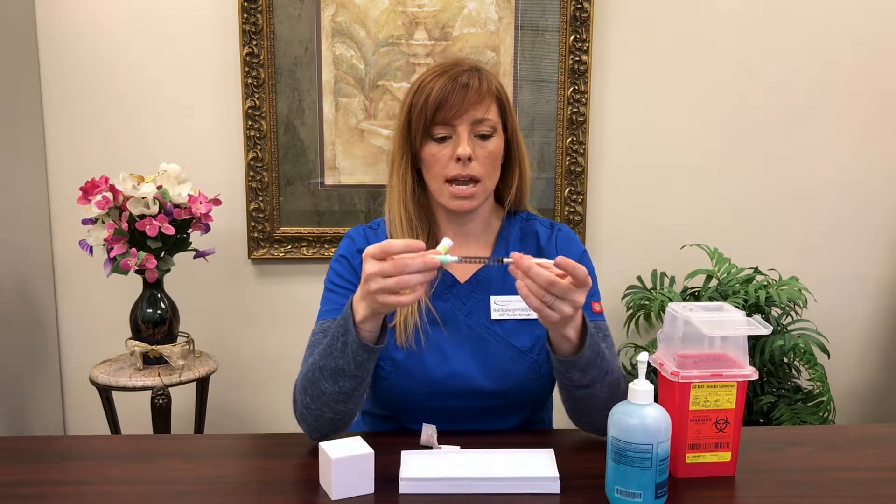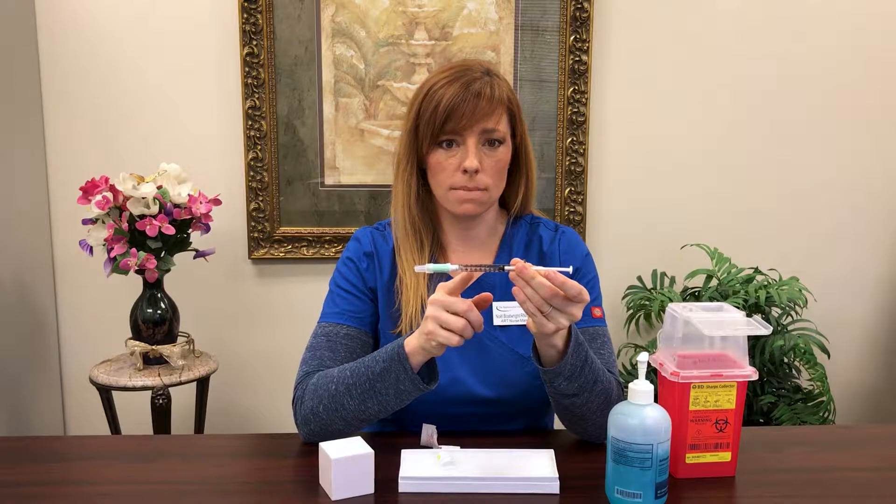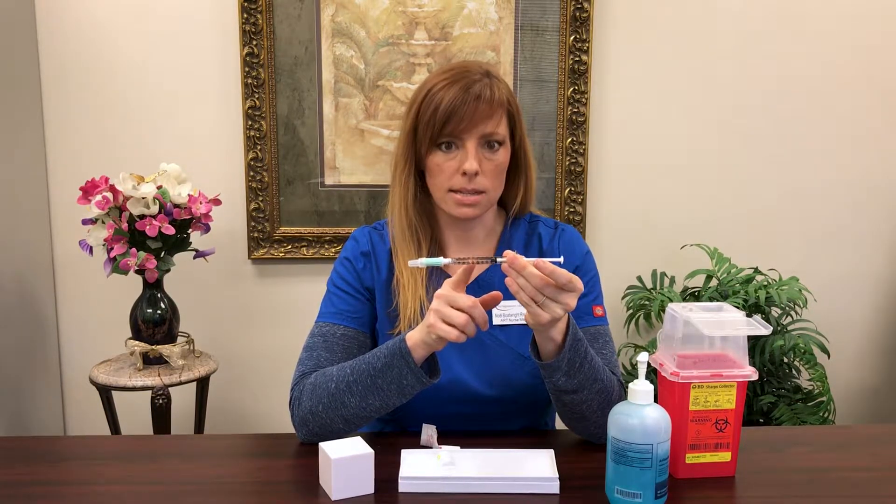With your syringe, everything is in here that you need. It is a clear gel that they mix your liquid in, so it may look like your syringe is actually empty — but never fear, there is medicine here.